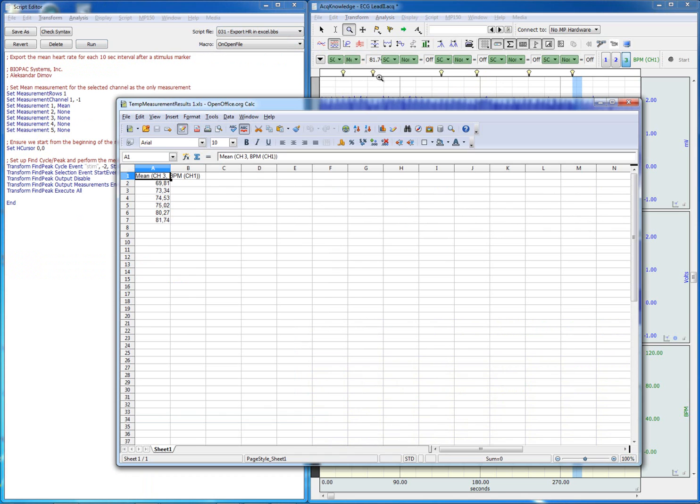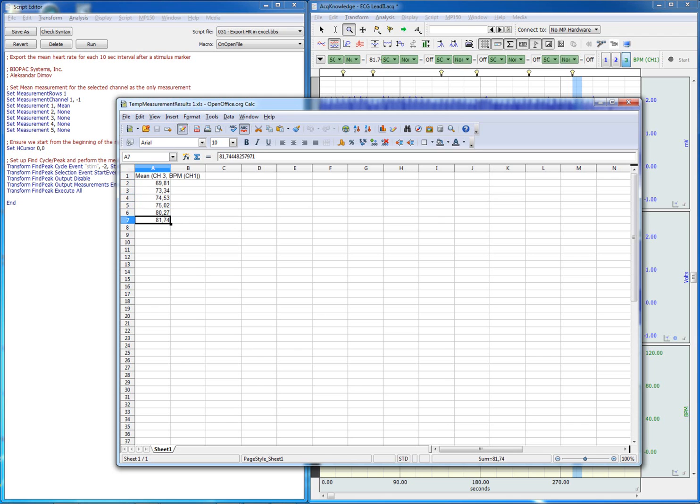As you can see there's six different stimulus events and then we have the mean heart rate for all six of them.